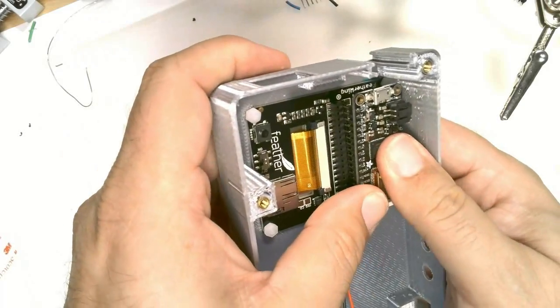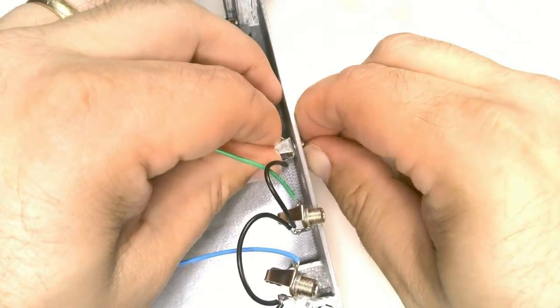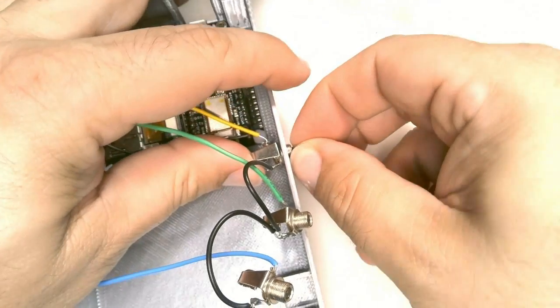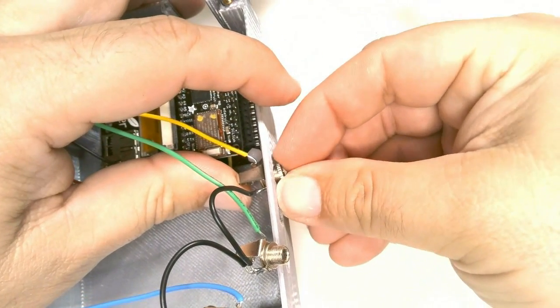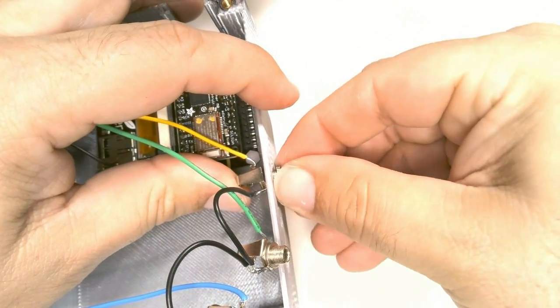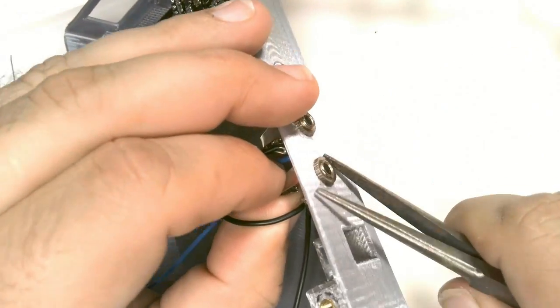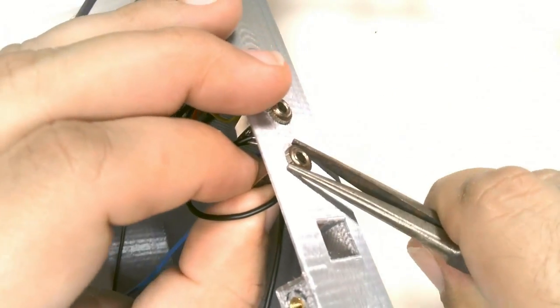Reinsert the feather board into the TFT display. Now we're going to mount the AT jacks into the holes in the side of the case. Secure each jack with the nut that is provided. Tighten them down with a pair of needle nose pliers.